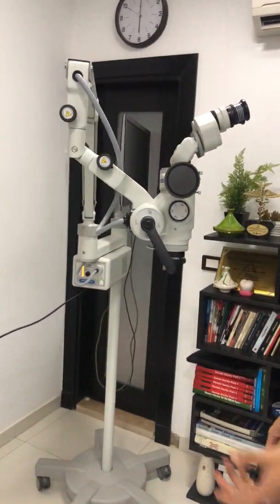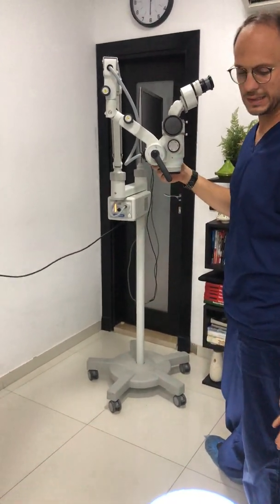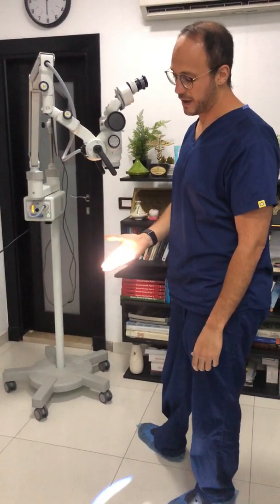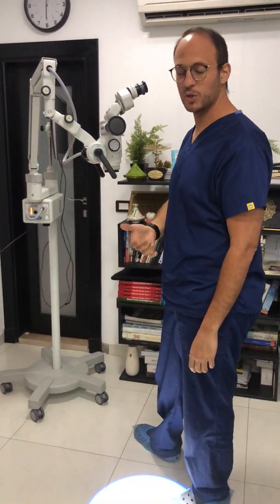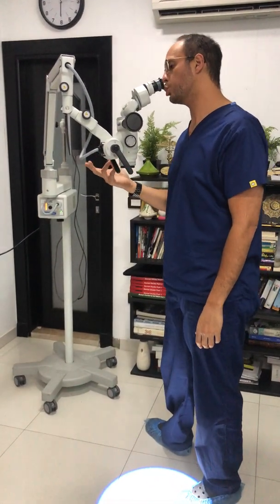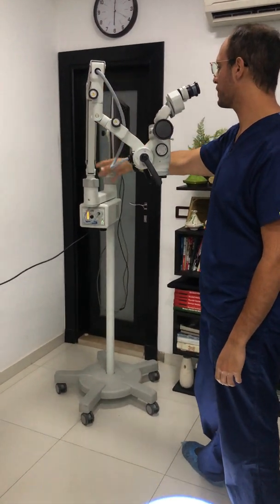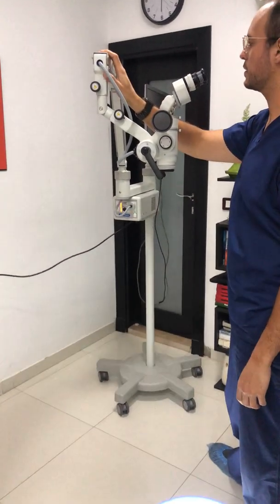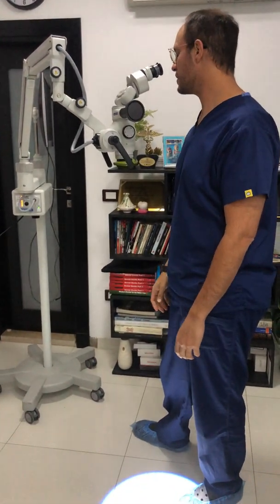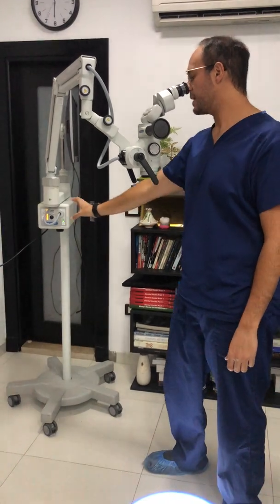Overall, it's slightly overpriced for the equipment and package it provides, at least in the Middle Eastern market. However, it is good quality, well built, and has a very high light intensity — likely the highest among what we are testing today — with very clear optics and quite good objectives. On the downside: relatively poor ergonomics, not the best aesthetic option, and mechanically blunt. So that's the review for the Optomic.